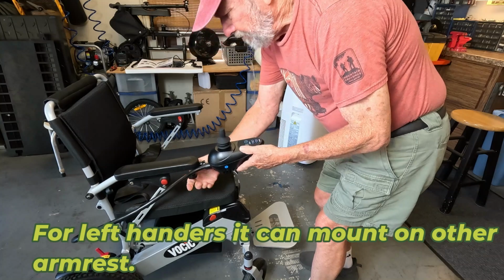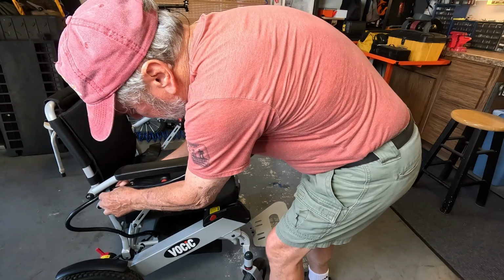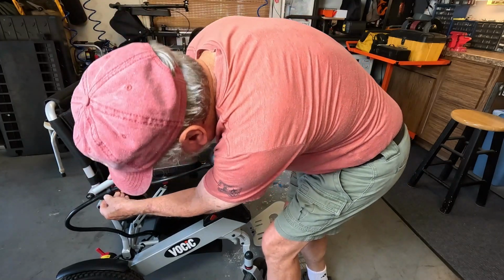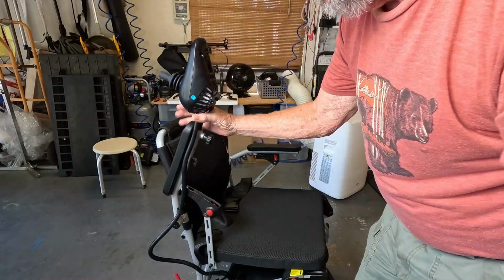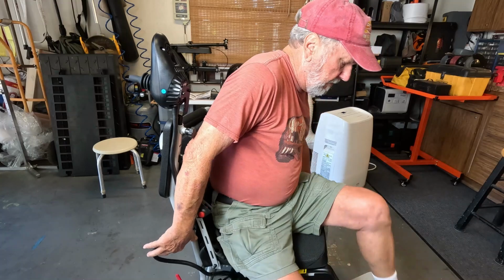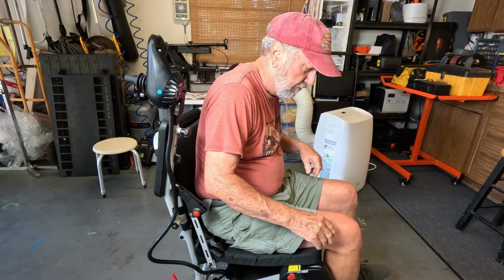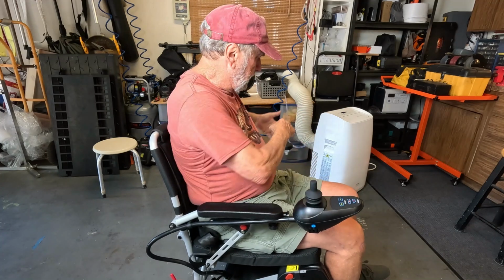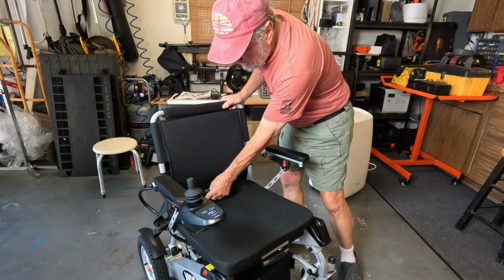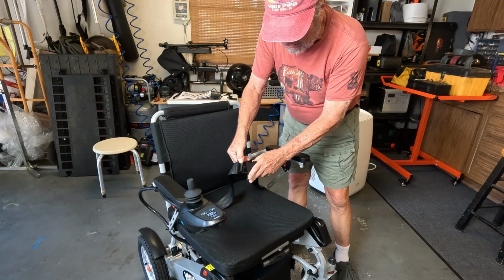Okay, and then this, you can put right up here, and that will hold it in position to keep it from moving around. You push in, and you may be on this side that you need to get in or out of the chair, and then you can swing around, and the footrest is down there. It will fit both feet. Then you can pull this down, lock, and you're ready to go. You can do the same with the other side. A seat belt right here operates to keep you from sliding out of the chair.